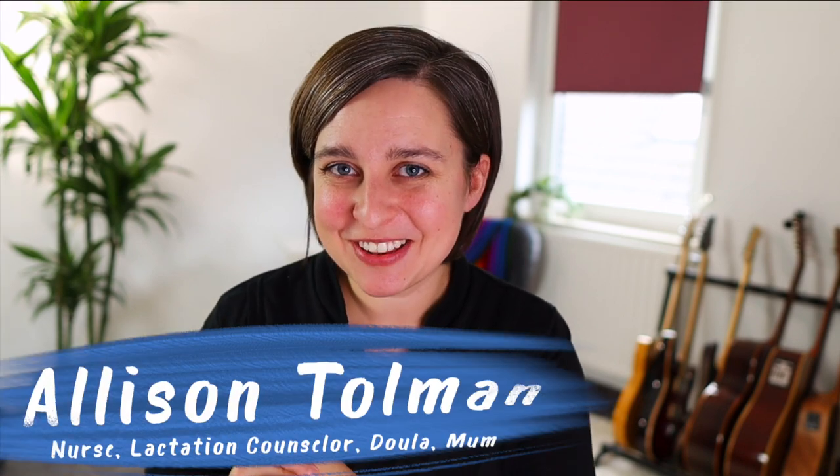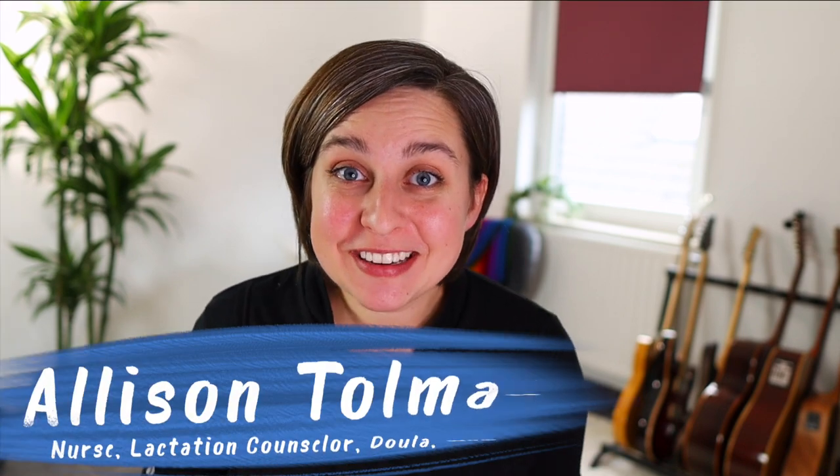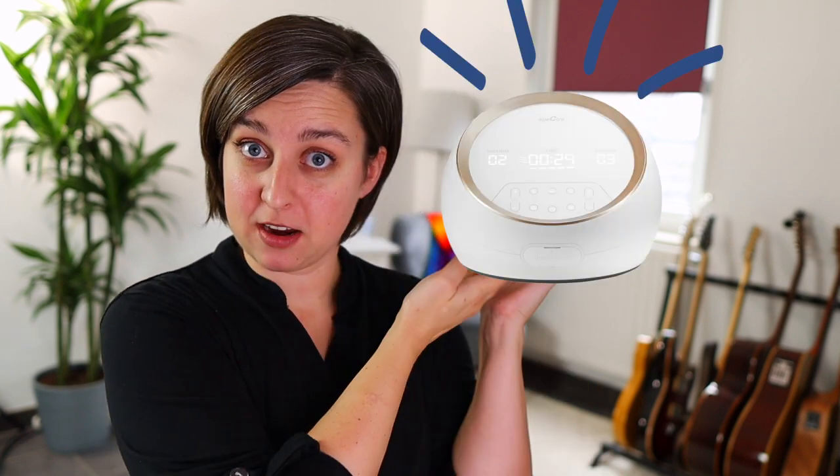Hey everybody, it's Allison here with New Little Life. Spectra is coming out with a new breast pump and I am so excited for this one. I don't think I've been this excited for a pump release in a while. Soon in the mail coming to me is a Spectra Synergy Gold, but I have this test model right here — thanks to Photoshop.